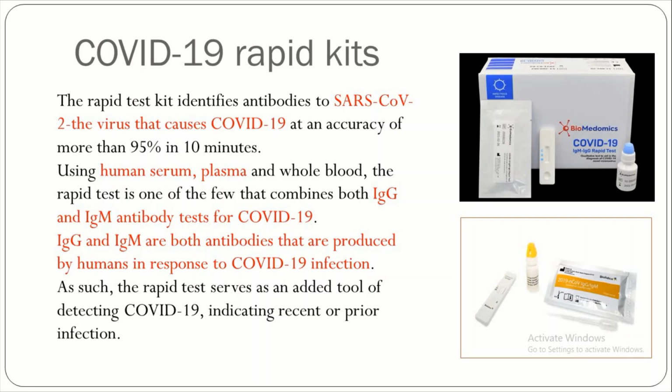Here also they have a control as well as a test site. In the test site, if it is positive, you also have to get a line in the control, showing the test is working, a kind of internal control. So this helps the patient identify within 10 minutes whether he was infected with COVID-19 or not.